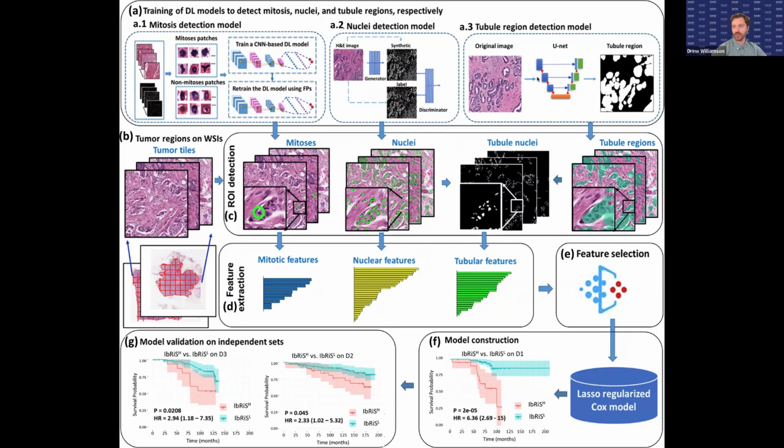And I think this, both this and the PathAI work, shows the kind of attraction of these human interpretable features, and that you can define them ahead of time. We know exactly what they mean, say the number or density of mitoses, and we can connect them either to some molecular alterations or some prognosis here.